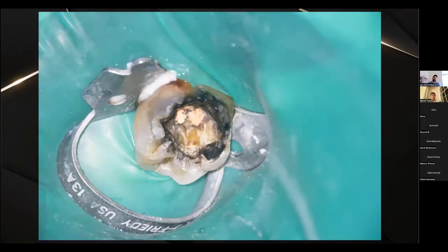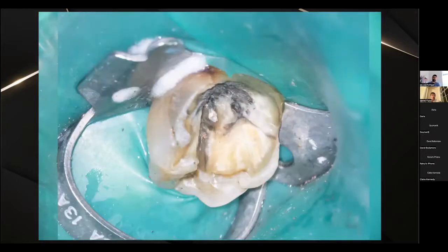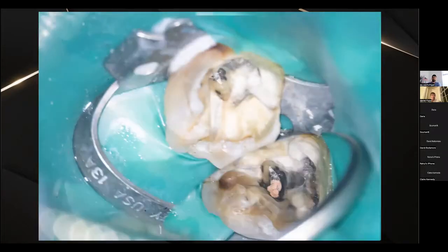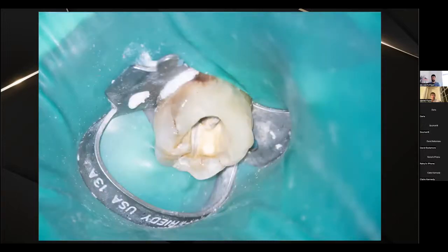So we've got our rubber dam on, temp out, caries out. Again, you've got these two fracture lines here, one on this mesiolingual wall, one along the distal, and it's not looking good, to be honest. There was a long conversation to be had with the patient about prognosis, but he was insistent he wanted to save this tooth, so I thought we'd have a go and see how we're doing. Those are the mesials, the distal not looking great.